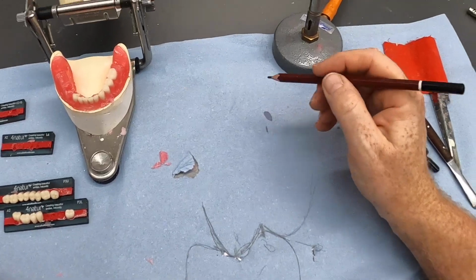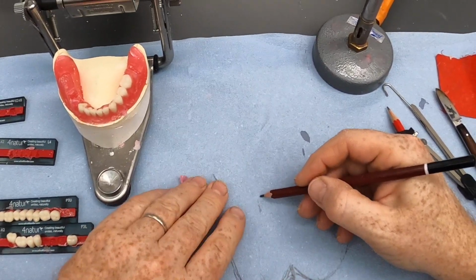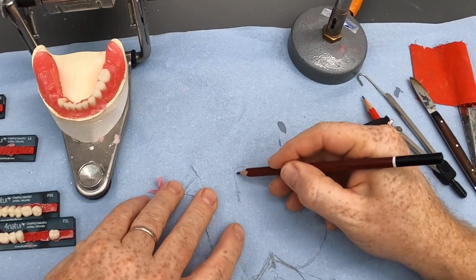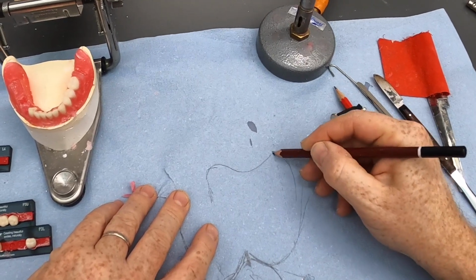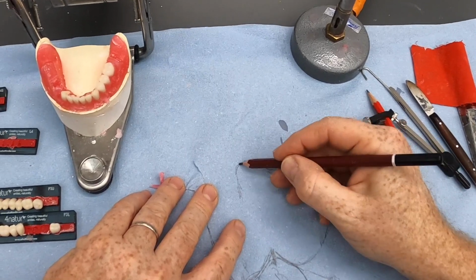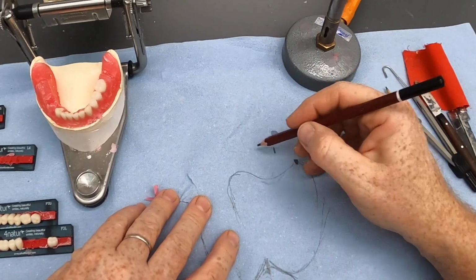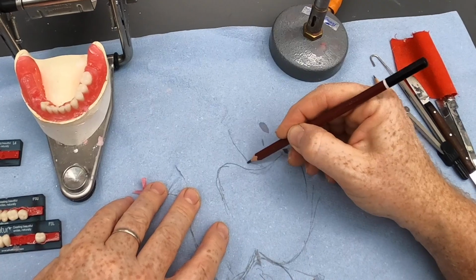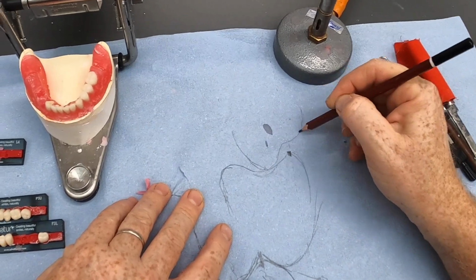which has been around for a long time, and most tooth manufacturers now make teeth for lingualized occlusion, where we have the lower cusps which are slightly reduced like so, so we have more of a bowl shape to the central fossa here, and then the upper tooth, rather than trying to create two contacts, we have the palatal cusp coming down into the central fossa like so, and the buccal cusp is reduced like so.